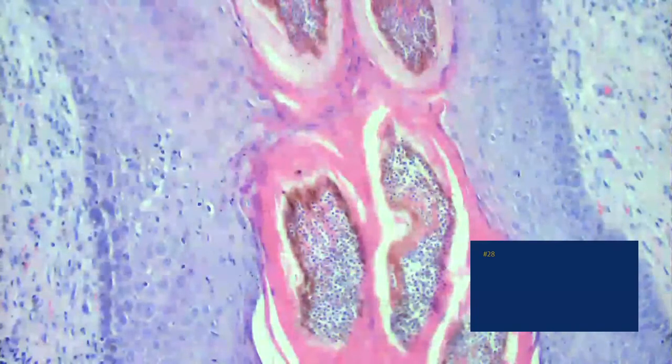And what's going on in the follicle? Little lymphocytes that are inside the follicles. Are those lymphocytes? No, they're... I'm not sure what those are, actually. Okay. Anybody want to give them a little help? Hyphae. Oh, yeah. And spores. And they're inside the hair shaft. So what's the diagnosis? Tinea capitis.